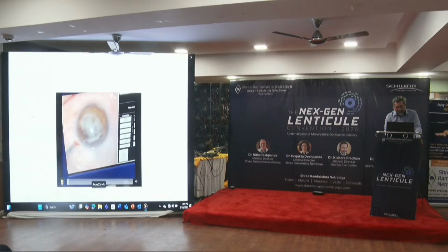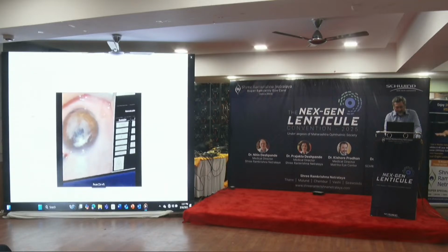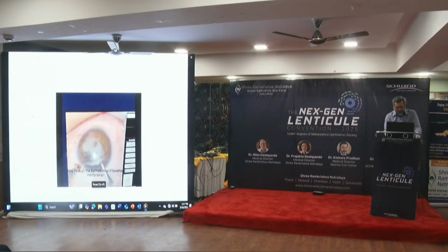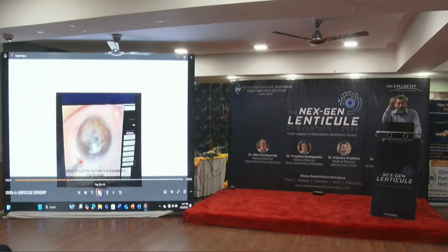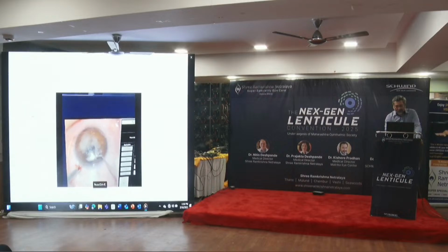And then I take over. What you have to understand is the eyeball is very, very soft. I try and look for the incision which hasn't happened. I've taken a 15-degree blade and I've just slipped it into the Bowman's membrane. The epithelium is about 50 microns, the Bowman's is 10. The moment you cut the Bowman's, you will enter the same plane exactly where you're supposed to be. So this is what I was doing. You can actually easily get into the plane.